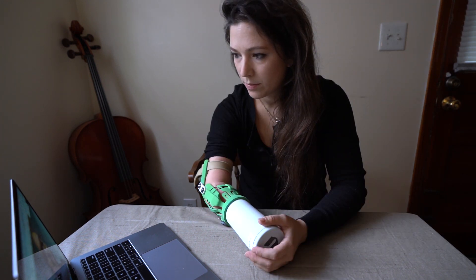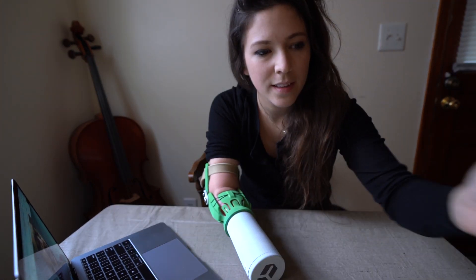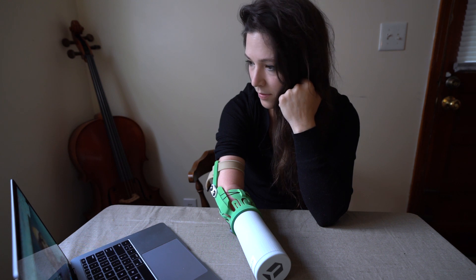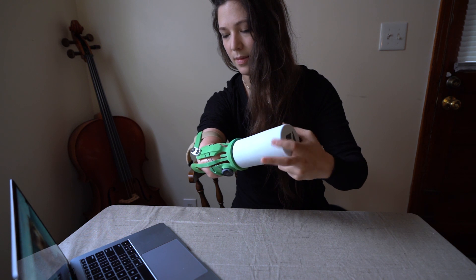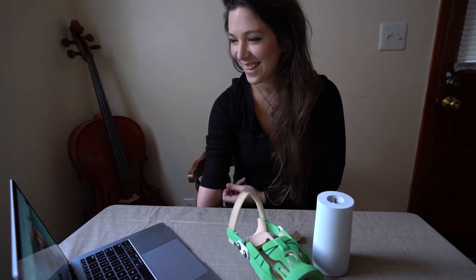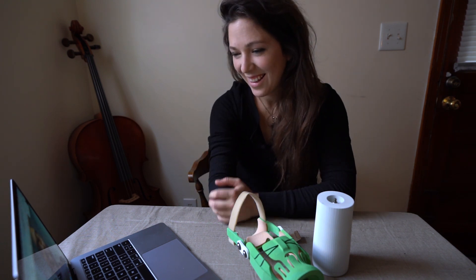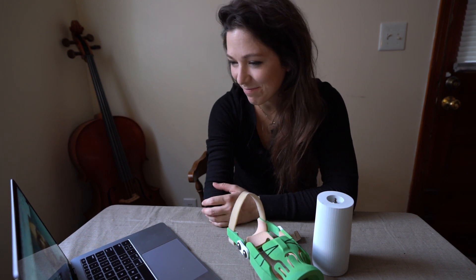Asked which socket felt most secure, Abby says definitely the green one. The clinician wraps up round one, explaining he'll take all the information and feedback and rework the sockets — making things tighter or looser as needed — then send a new set, hopefully leading to a final product. They thank each other warmly and say goodbye.